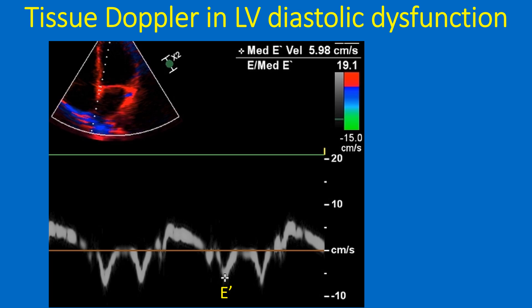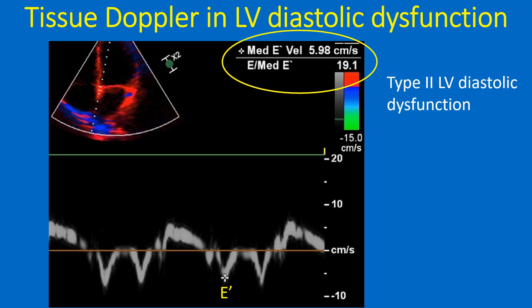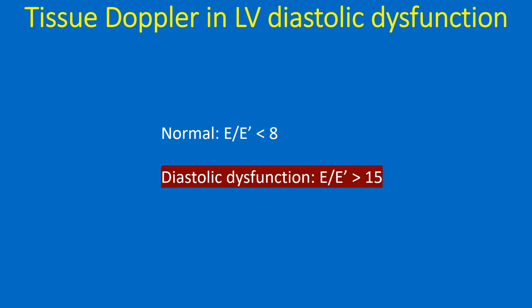Tissue Doppler imaging with color kinesis in the inset is shown. E by E prime of the medial mitral annulus is shown as 19.1, indicating Type 2 left ventricular diastolic dysfunction. In diastolic dysfunction, as ventricular relaxation is impaired, the velocity of the medial mitral annulus is reduced and the E by E prime ratio is increased. E wave is measured prior to tissue Doppler imaging and stored so that the software displays E by E prime as soon as E prime is measured. E by E prime below 8 is considered normal, while a ratio above 15 indicates left ventricular diastolic dysfunction. E by E prime has also been correlated with left atrial pressure — effectively the left ventricular filling pressure — which increases in diastolic dysfunction.